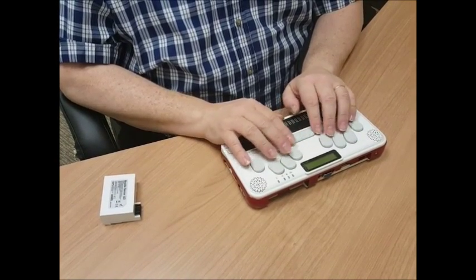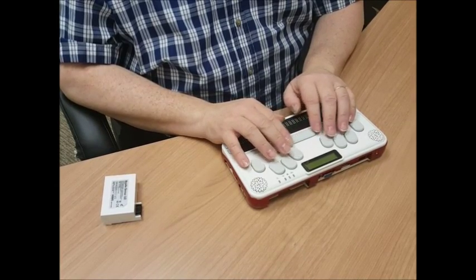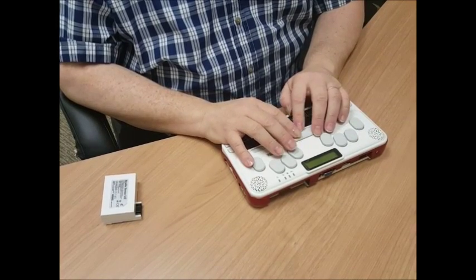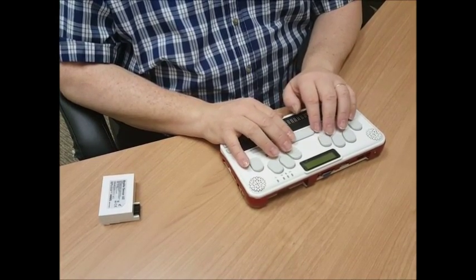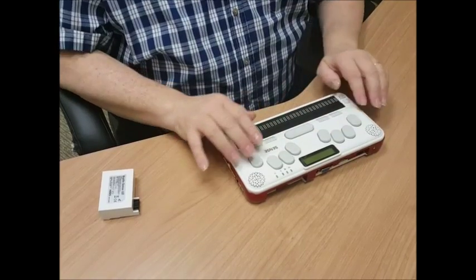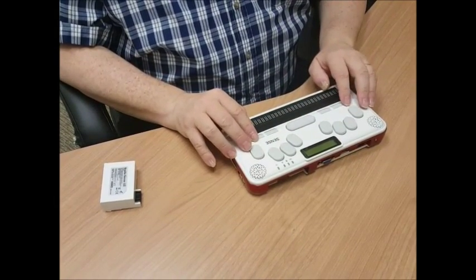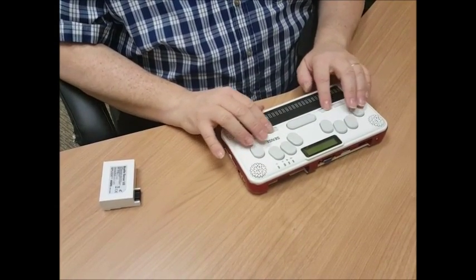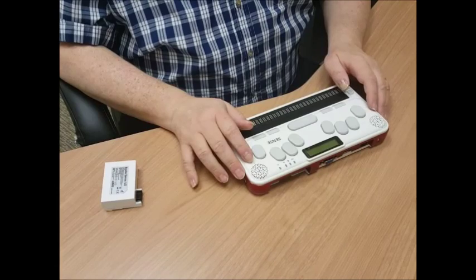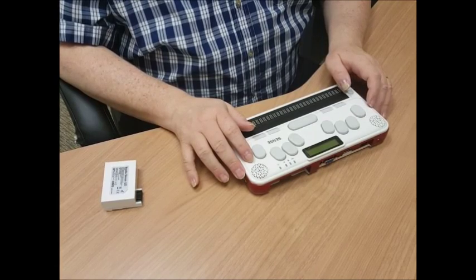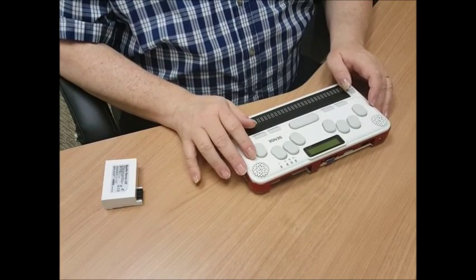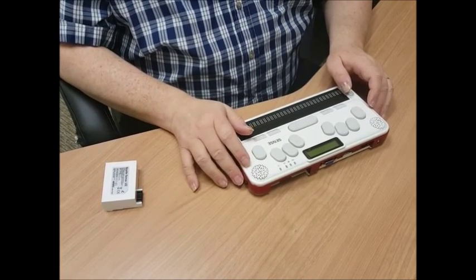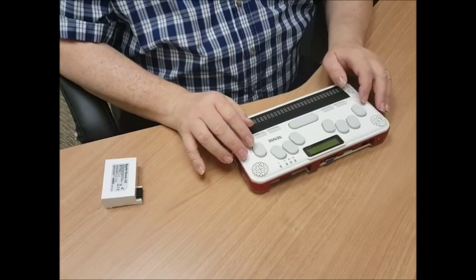Below that, kind of horizontal, is a long sort of bar. That's the space bar. On both sides of that space bar are four little rectangles. From the left to right they are F1, F2, and the space bar, F3, F4 on the far right.